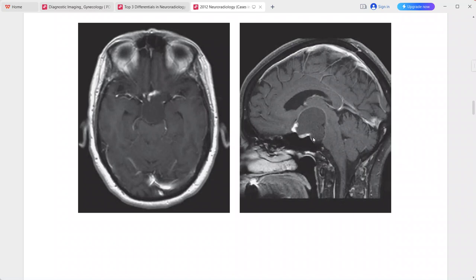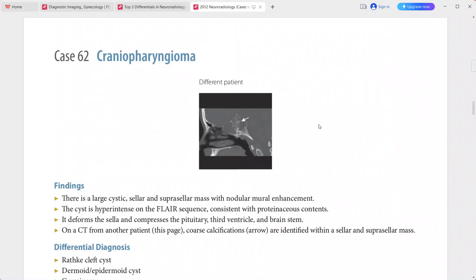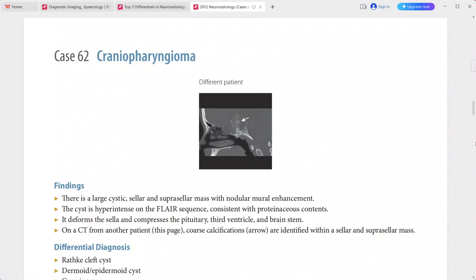This is a typical imaging picture of craniopharyngioma. A CT from another patient shows coarse calcifications in this location, also characteristic for craniopharyngioma. Differentials include Rathke cleft cyst, dermoid/epidermoid cyst, germinoma, cystic pituitary adenoma, hypothalamic-chiasmatic glioma, and partially thrombosed aneurysm.